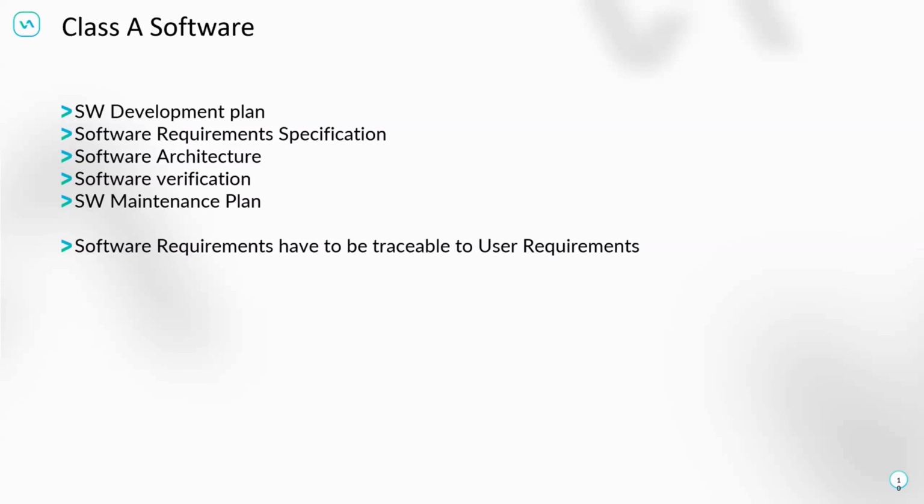Then the next step is the software requirements. The standard gives a hint that you shall have functional requirements, quality requirements, non-functional requirements, performance requirements, and so on, always if needed. So you don't always have to do that. If your product is quite small, quite simple, and you don't necessarily have timings, architectures, and certain frames you need to consider, then in these cases you do not need to take care of all the requirement sections. The functional requirements you always need to have, because this is what your product shall do.